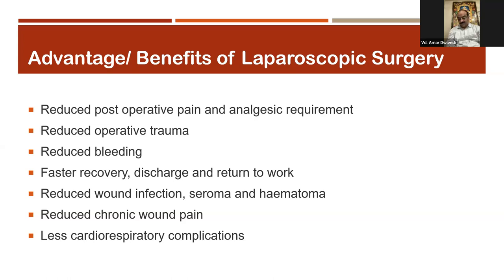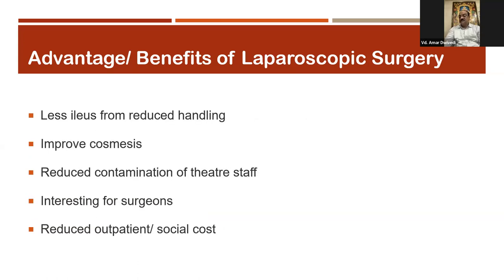Initially, definitely, the learning curve is very high, but nowadays even bigger procedures are performed faster than open surgery with the help of laparoscopy. Another big advantage of laparoscopic surgery, compared with laparotomy, is less ileus from reduced handling, because here we do not handle the whole abdominal bowel as in laparotomy, but only touch the tissue limited to our operative field. Definitely it improves cosmesis and also reduces contamination of theater staff.